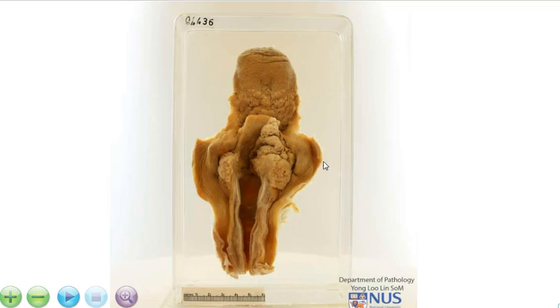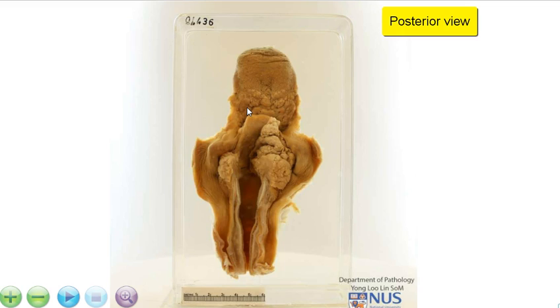Hello. We're looking at the posterior surface of a specimen from the upper aerodigestive tract.